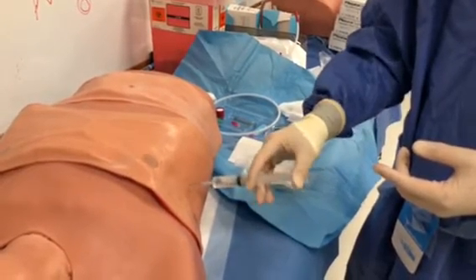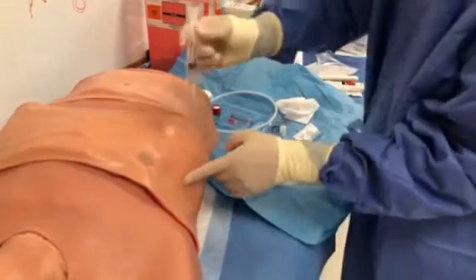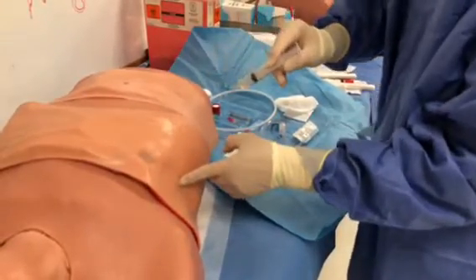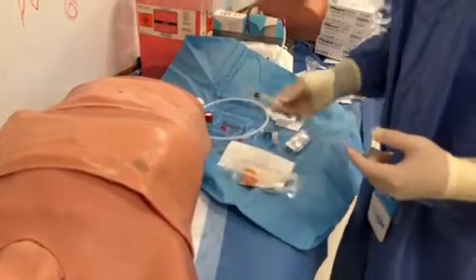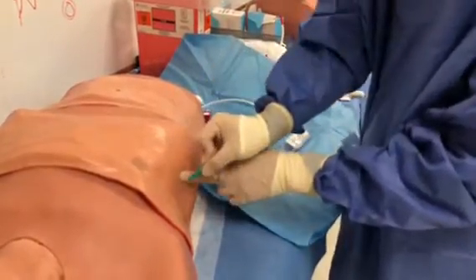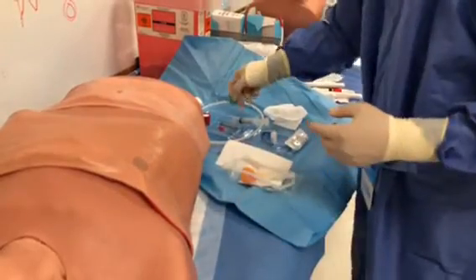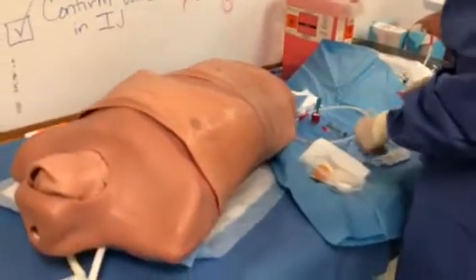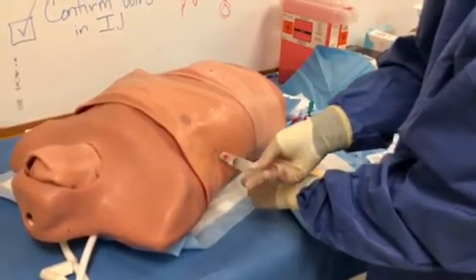You withdraw slightly and give a good block. One thing to remember: you create a wheal first — make sure you get a good numbing block at the skin before you inject deeper. Now you've confirmed the location. All you have to do is make a small incision, which will be big enough for a 12 French.